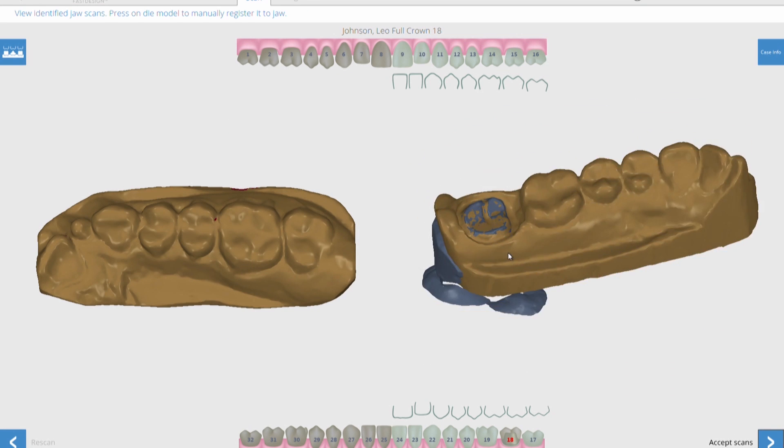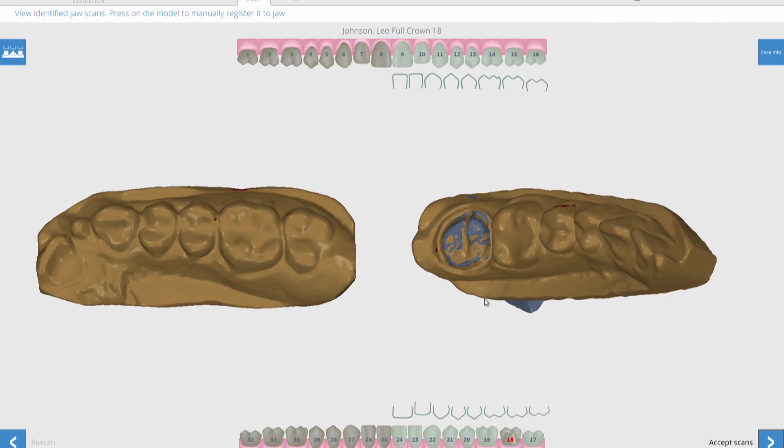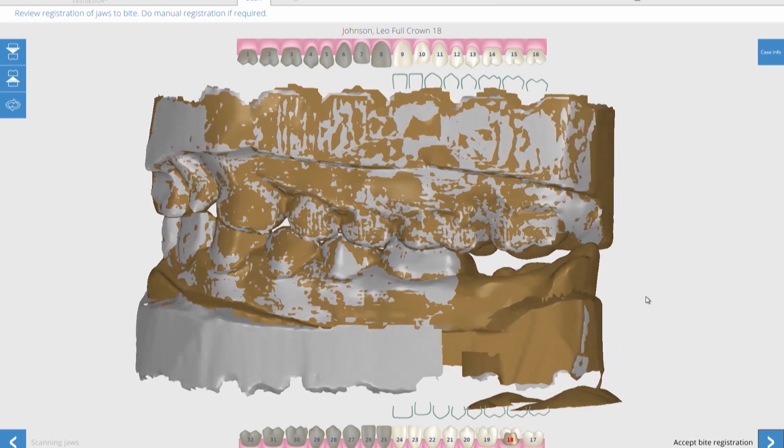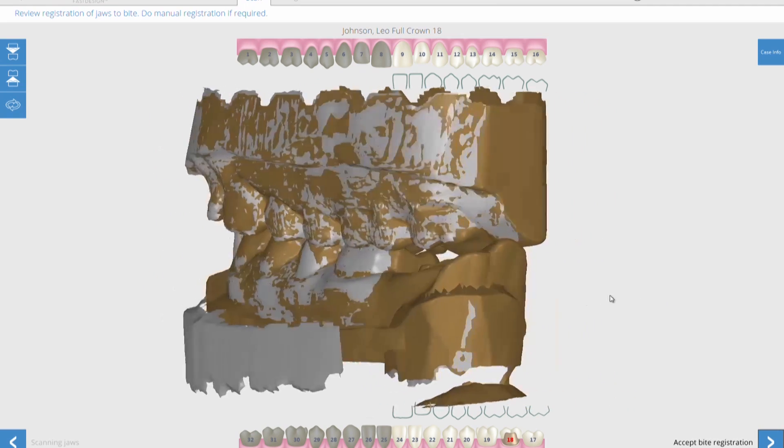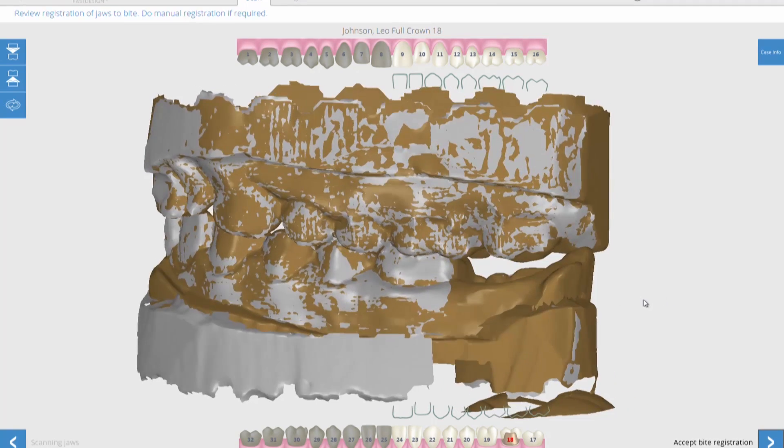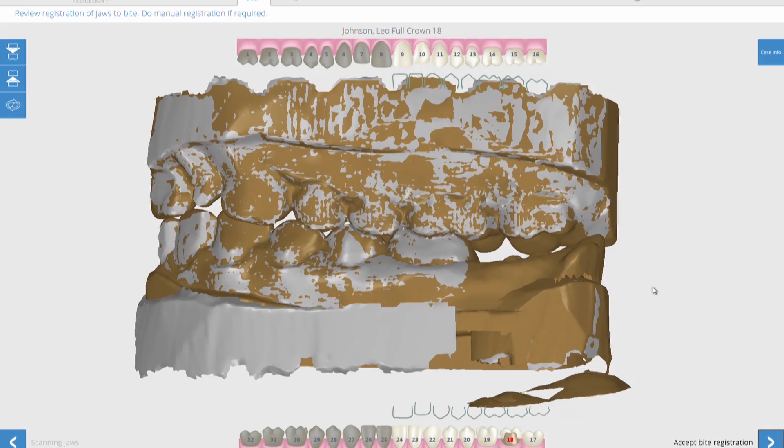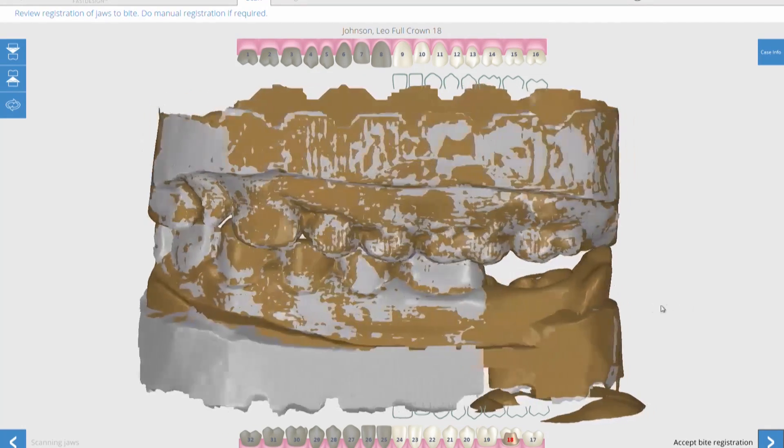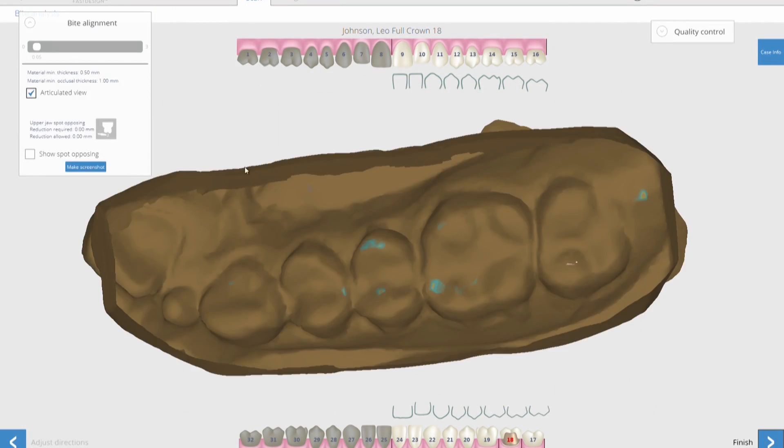You can see that little blue area now where it's taken the die that was sawed out of there and correlated it with the solid model. So it's identified those two teeth and it's able to articulate those two models together. And again, you can see the gray and the yellow showing where there's areas where it's come together and it correlates and it finds the bite for those two.